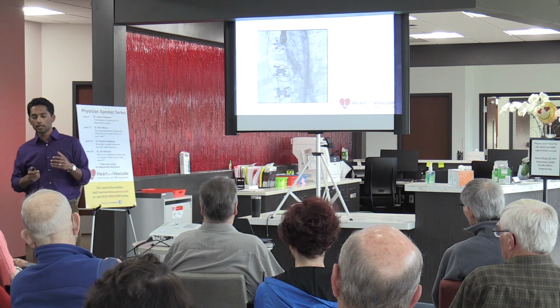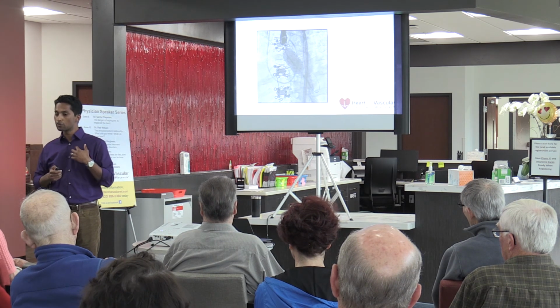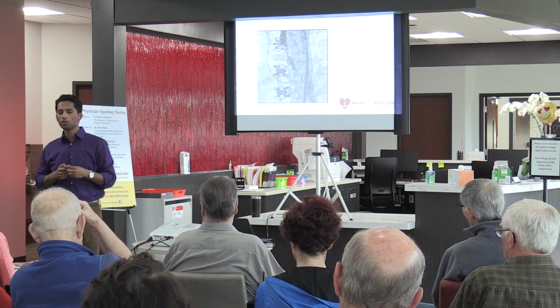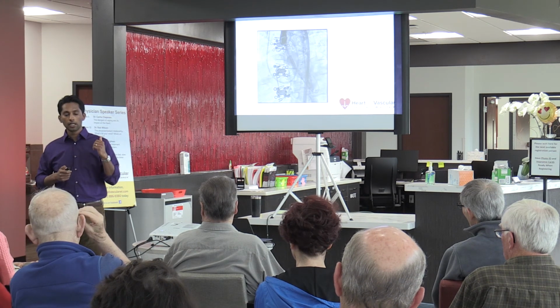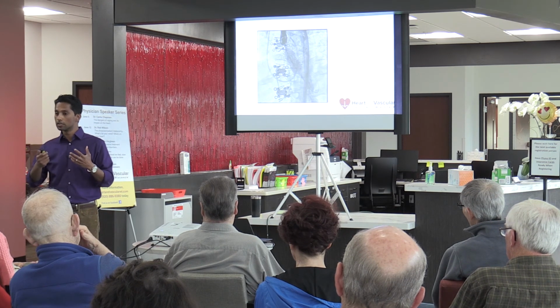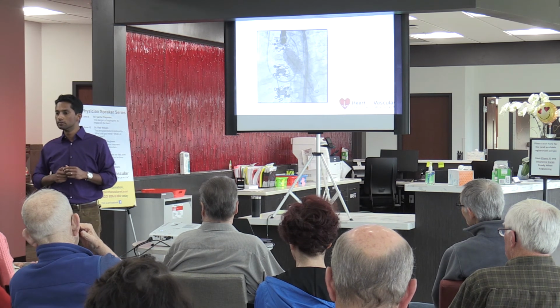Now that being said, for people that have a bioprosthetic valve in the mitral position, we're able to put one of these valves in that mitral valve, but only because you've already got a valve there to begin with. There are minimally invasive technologies coming out to fix mitral regurgitation. Those are still in the works. They're not exactly prime time yet, but stay tuned.